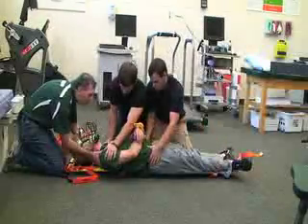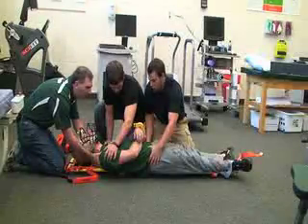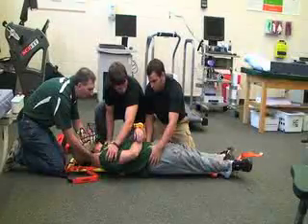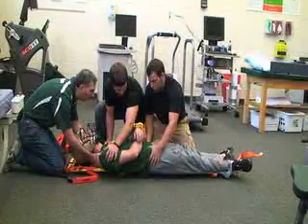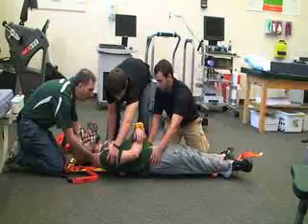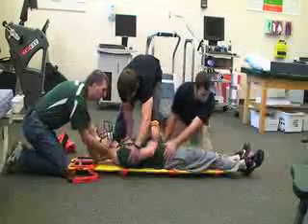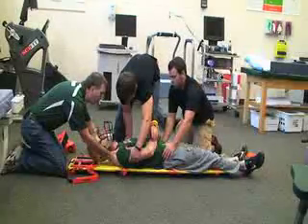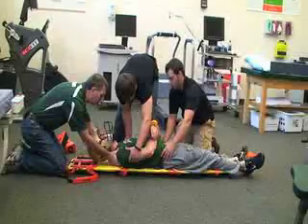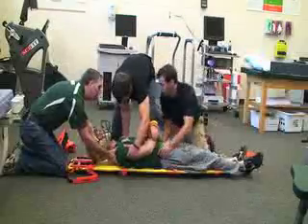The victim's not centered on the backboard, so we're going to have to grab the shoulders and the hips and slide them down in unison while I stabilize the head. Ready? One, two, three. Then on the count of three, we're going to slide them back to the center of the board with his head on the yellow piece. Ready? One, two, three.